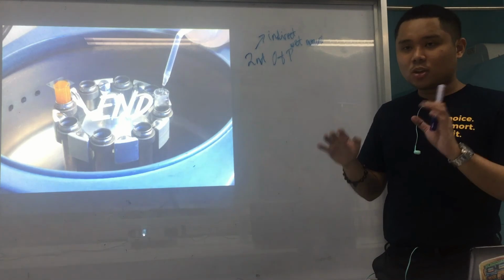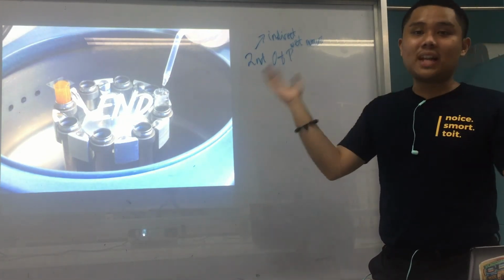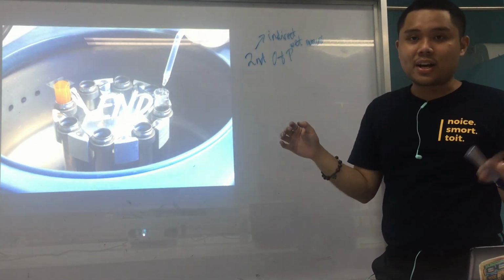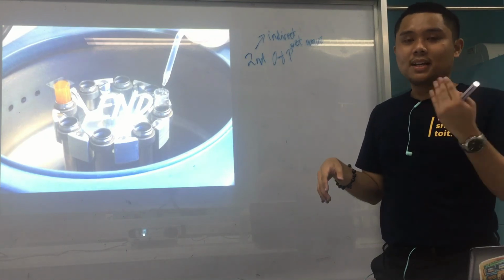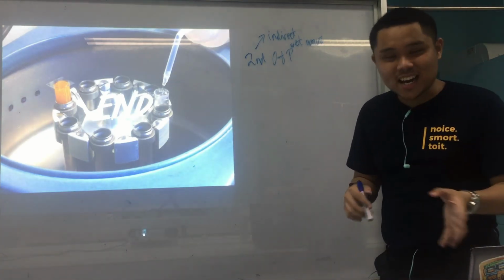And aside from that, concentration, by the name itself, you concentrate, you aggregate, you accumulate, you gather all the parasites that can be found in the stool sample, with less fecal debris in examination. That's why it's much easier and much more accurate to perform. And you can identify the parasites easily also. All right. So that's all again for concentration techniques.